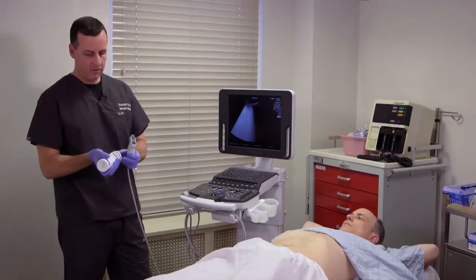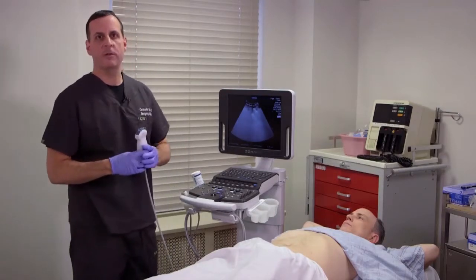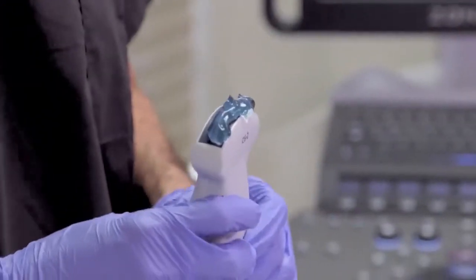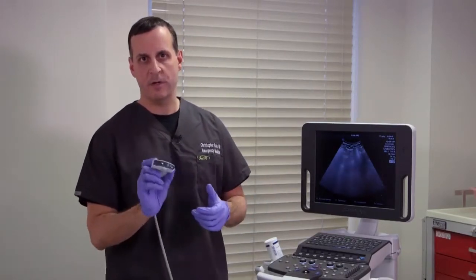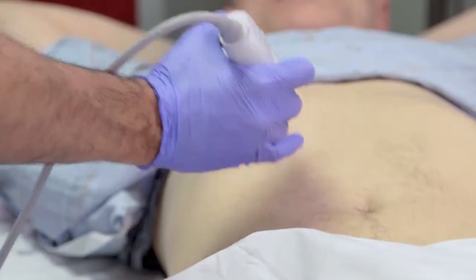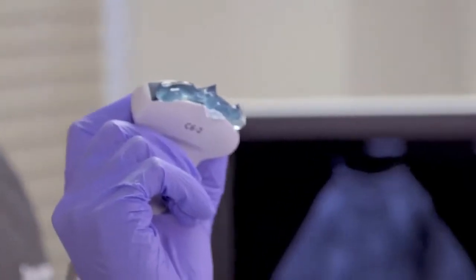Now that we know where the notch of our transducer is, we're going to gel up our probe. For most applications — pretty much all of them other than some of the cardiac work — that notch of your transducer is going to be facing either the patient's right or the head of the patient as you're performing your exam. One last thing before we get going: how to hold the transducer. You want to be as close to the probe surface as possible — that gives you much better control and allows you to rest your hands on the patient while scanning, stabilizing the transducer. Avoid holding the probe far back, as that leads to instability.